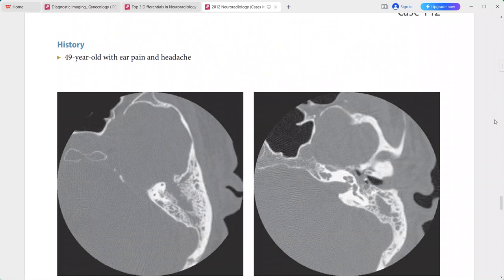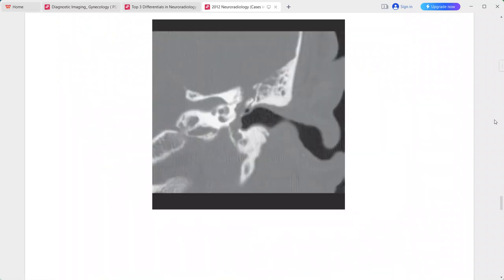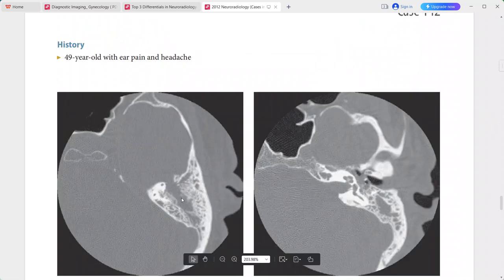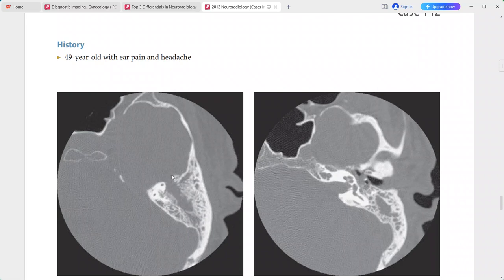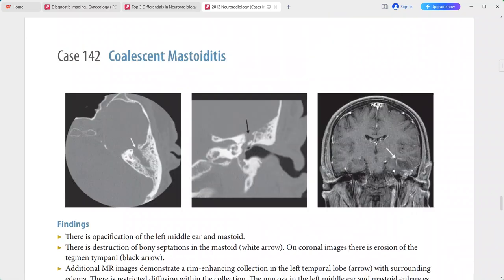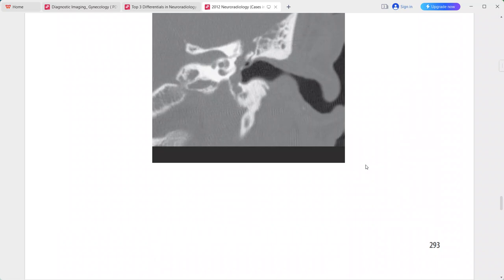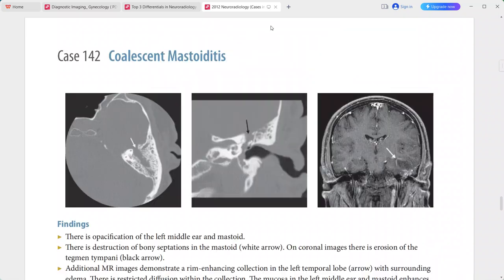A 49-year-old man presenting with ear pain and headache. There is opacification of the left middle ear and mastoid with destruction of bony septations in the mastoid. On coronal images, there is erosion of the tegmen tympani.